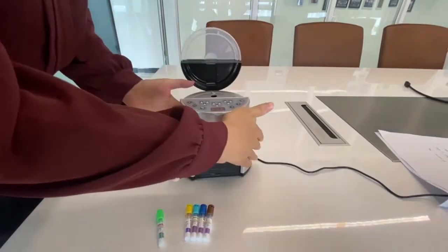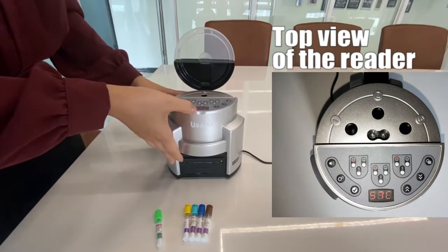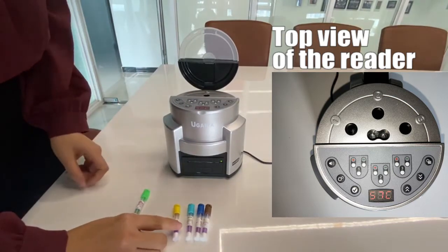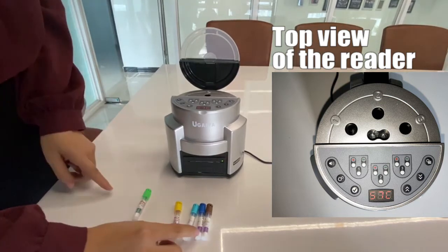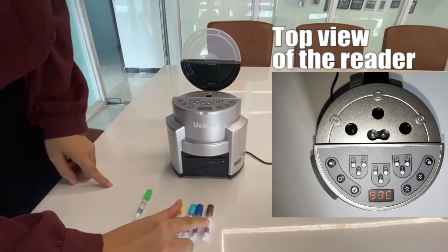We have two modes. The first mode is for 58 degrees centigrade incubation. In this mode we can incubate four types of BI: 20-minute VHP BI, 20-minute steam BI, one-hour steam BI, and three-hour steam BI.